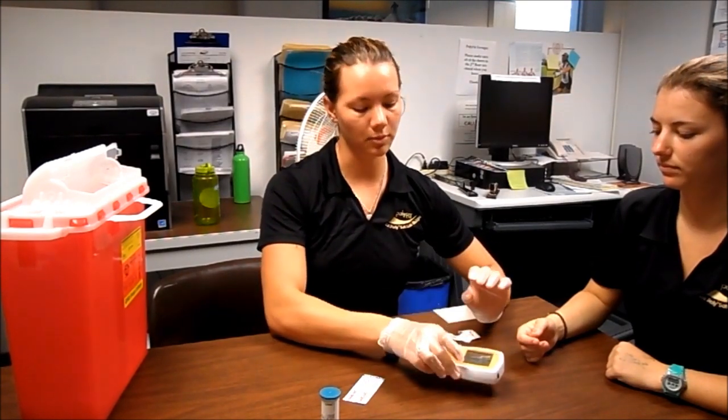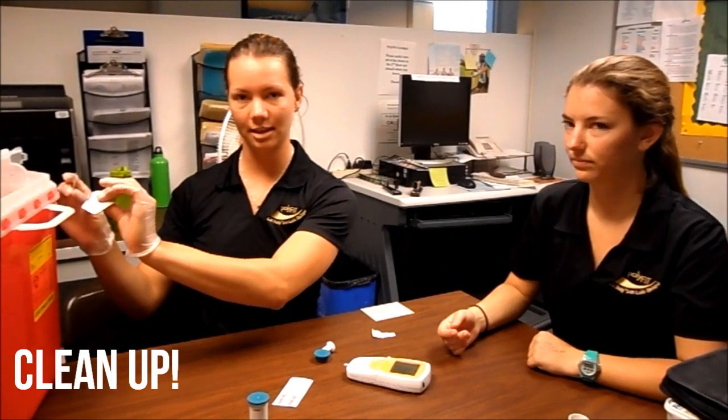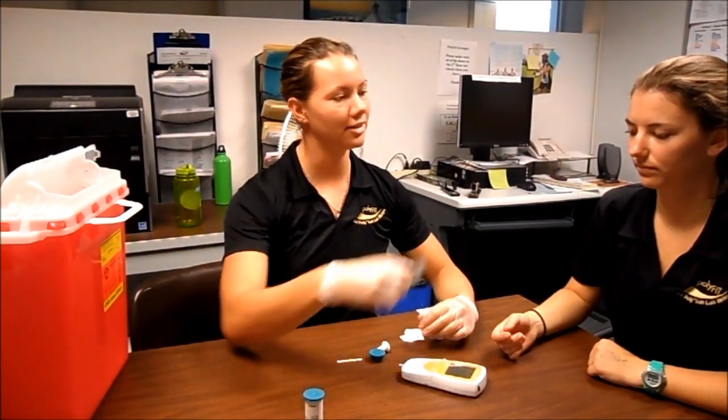This test takes three minutes, so while you're waiting you can clean up your area, putting all things that contain blood in your sharps container, and offer your client a band-aid.